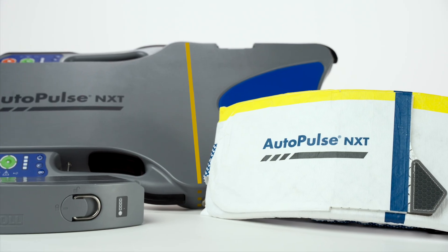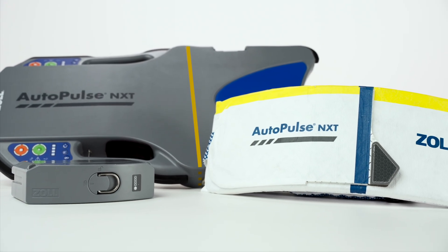We have now reviewed the buttonology of the AutoPulse NXT resuscitation system.